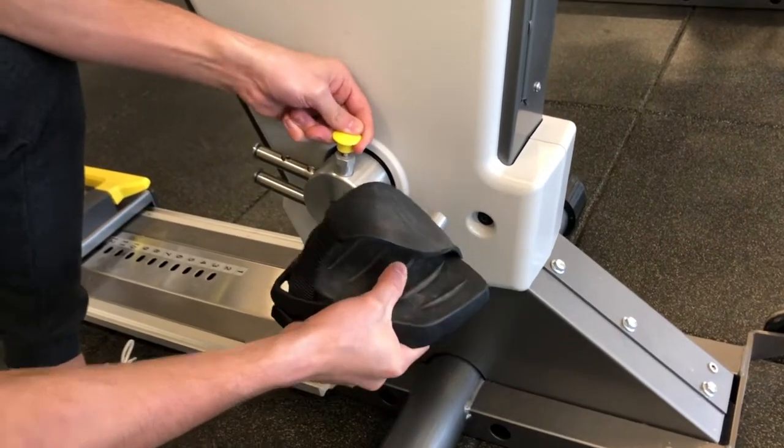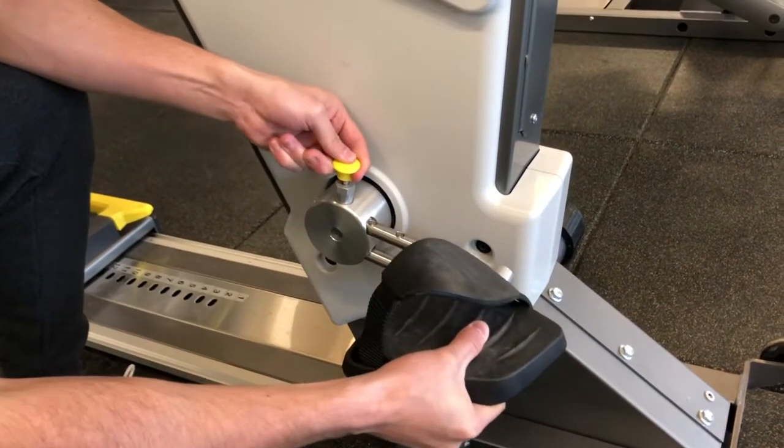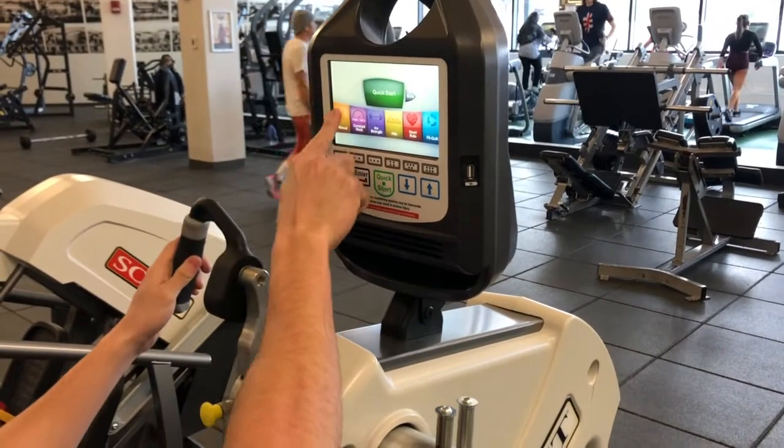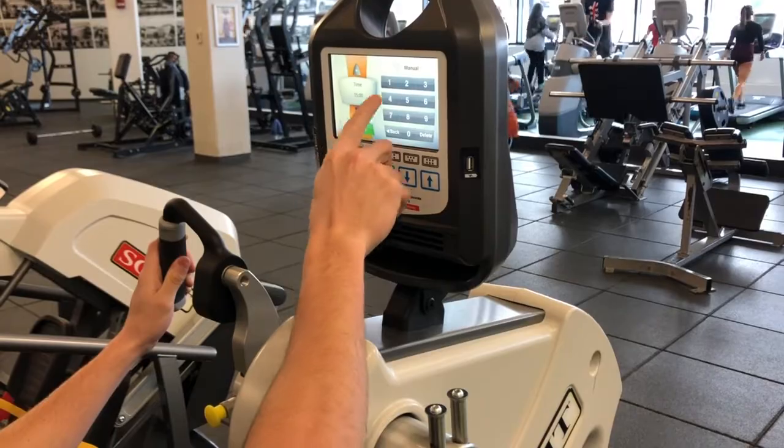The foot pedal cranks can be adjusted the same way and should allow for a slight bend in the knee at full extension. Once you are ready, select one of the many workout options on the screen and start exercising.